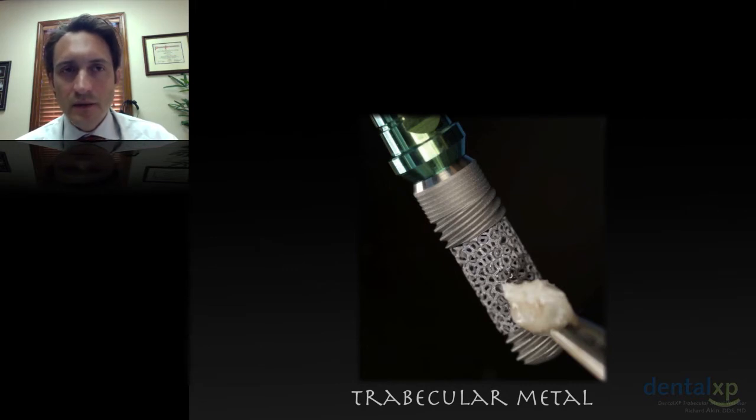In fact, I try to use it in almost all implant cases, and I've found that applying this PRGF to the surface of the tantalum is a nice way to deliver it to the site. And here it is. This is fraction 3. For those of you that are familiar with PRGF, fraction 3 is the most concentrated portion of the 3 fractions of PRGF. And this is what I usually will add my bone to. And in this case, I'm using a xenograft bone.